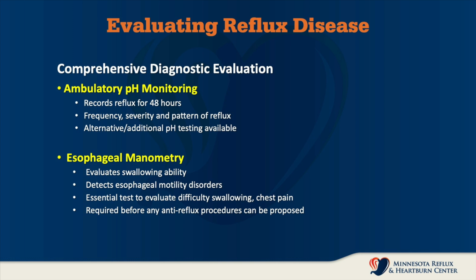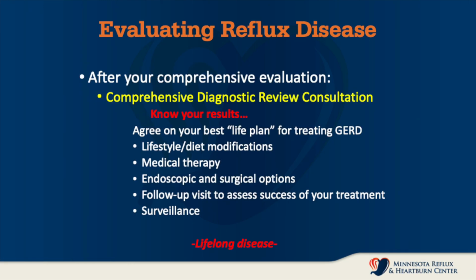We do have a lot of patients that have been to the emergency room feeling as though they've had a heart attack. Once a cardiac evaluation has been ruled out, they are often referred to our center, and it is often reflux disease or, as I'm saying, a motility disorder. So that concludes the basic comprehensive reflux evaluation: the endoscopy, the biopsies, the ambulatory pH testing, and the esophageal manometry. Certainly we have additional tests in our toolbox that we can use for further evaluation.